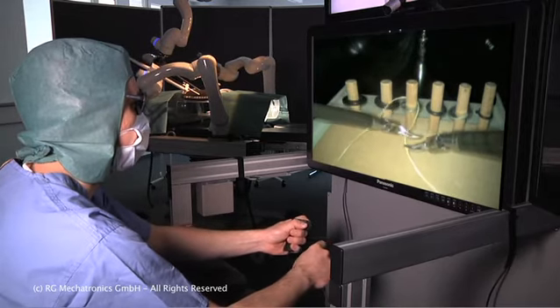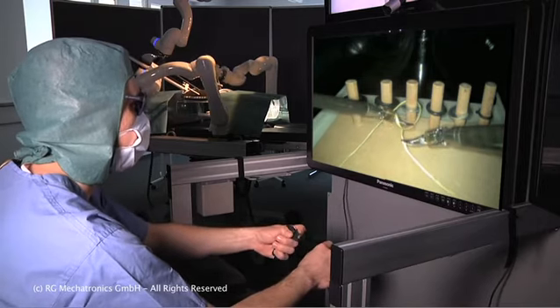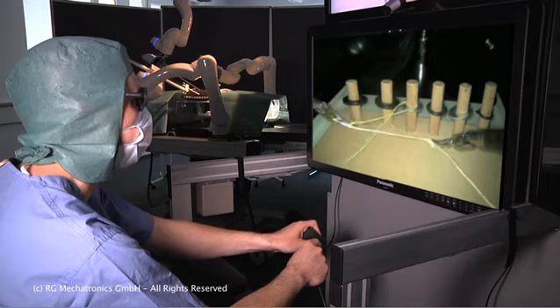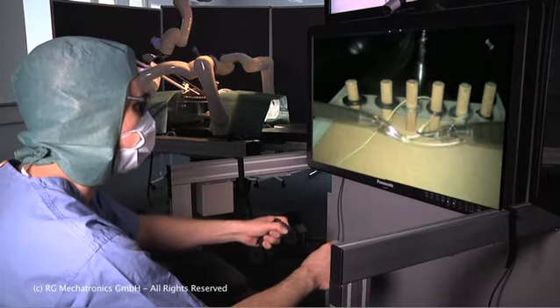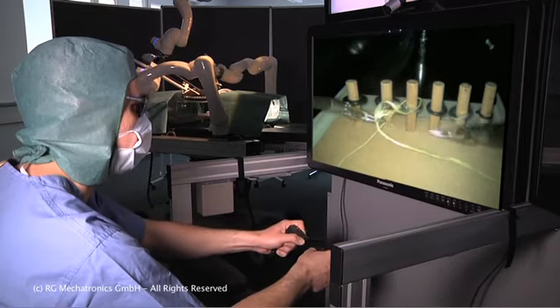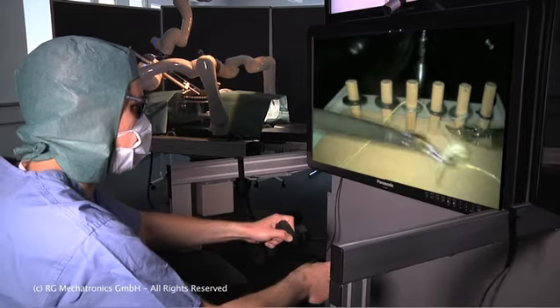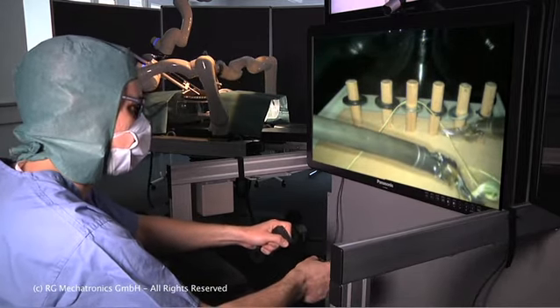The alignment procedure has been significantly simplified since the earlier versions. As you can see, it was possible to begin operating very quickly. In this case, the surgeon has lifted his hands well off the elbow support, but it would be possible to reposition the input device and then continue the operation from a more comfortable position if required.